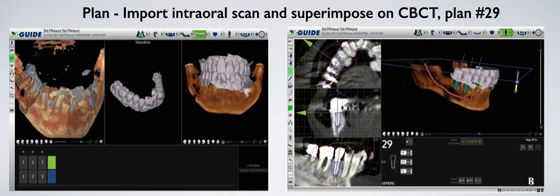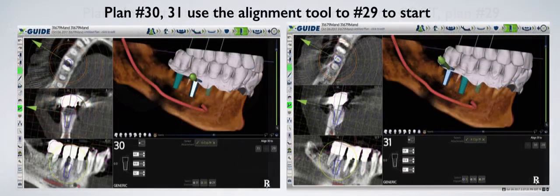Next, we superimpose the intraoral scan onto the DICOM file — you can see at least three points need to be used. On the right screen, we're putting a virtual implant into tooth number 29 for paralleling purposes only; we are not going to be placing an implant there. We then plan teeth number 30 and 31, again using the align tools. You'll see we first align implant number 30 to 29, and then 31 to 30.